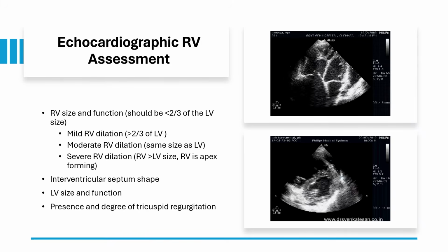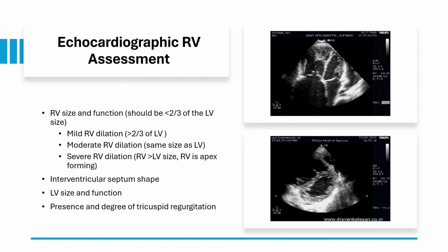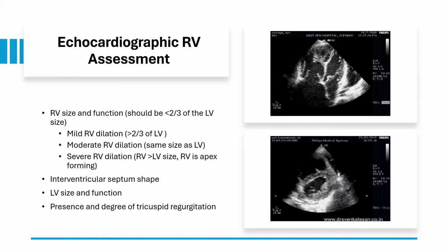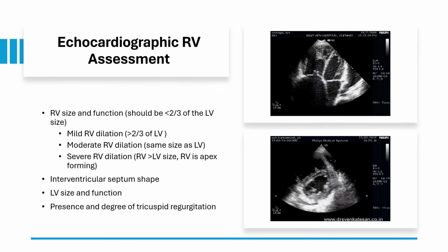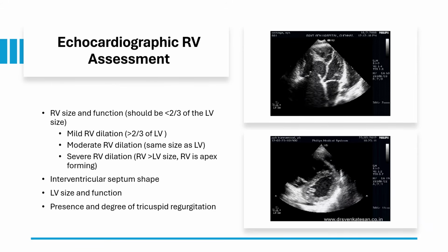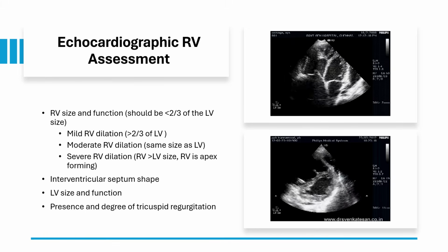Again, you also want to assess the size and function of the left ventricle, see if it is underfilled to get an idea about the LV cardiac output. You also want to assess the presence and degree of tricuspid regurgitation. Please pause the video if you need more time to review this important concept.